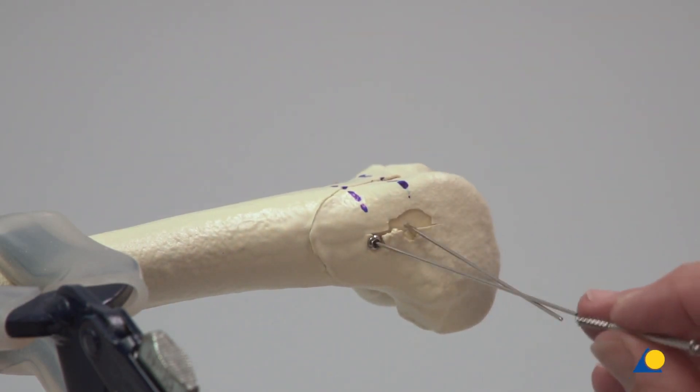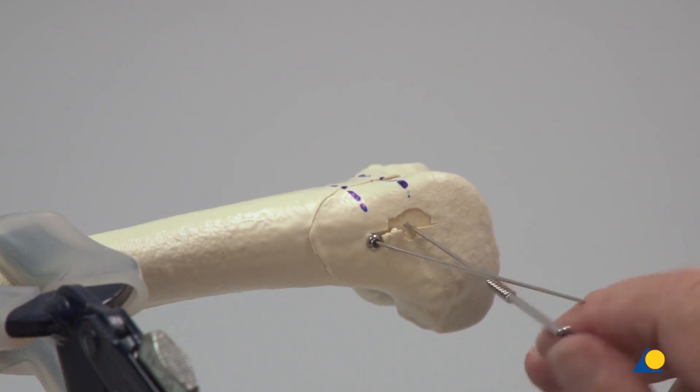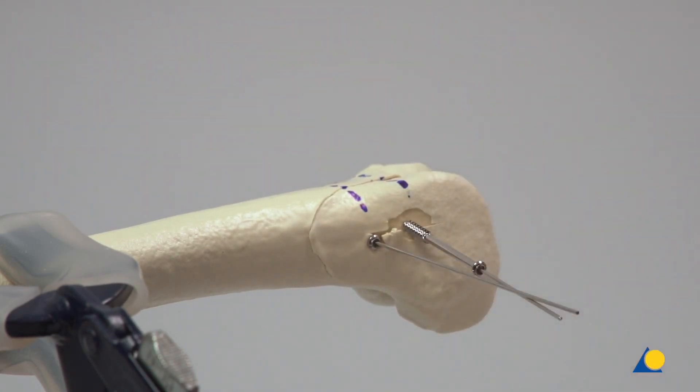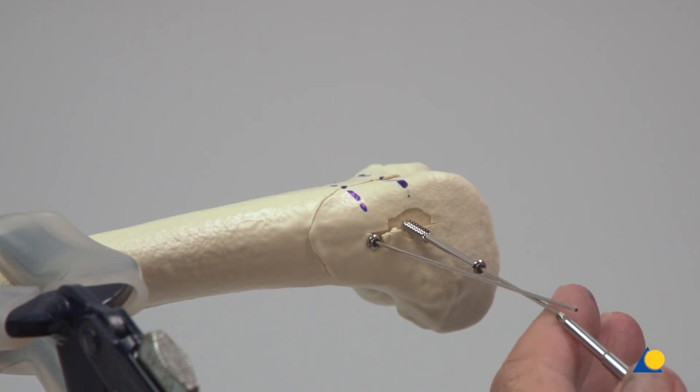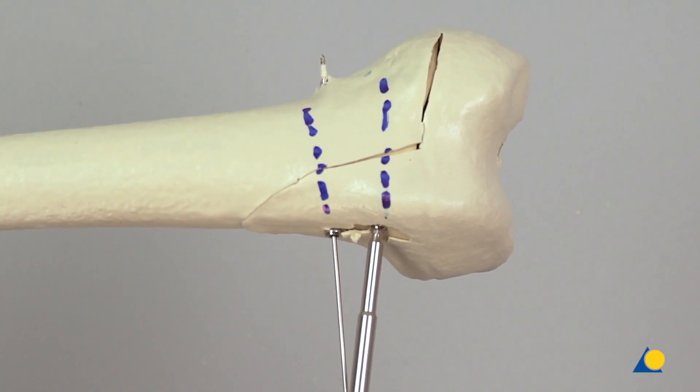The second screw is inserted in the same manner. An additional washer may be required depending on the quality of the bone or the preference of the surgeon. Note that in this exercise, no washer has been used.